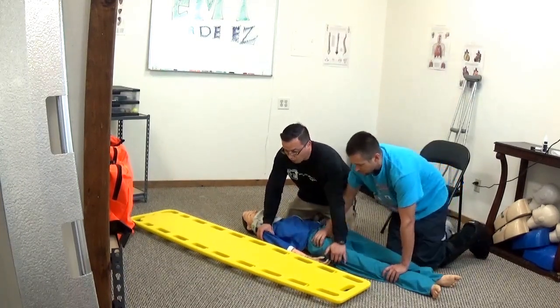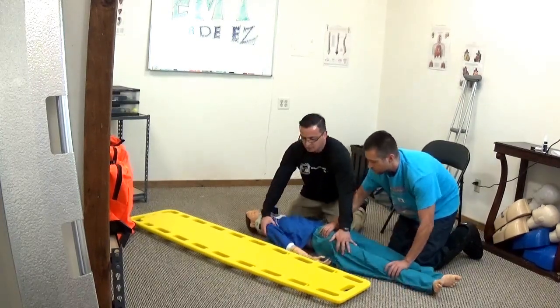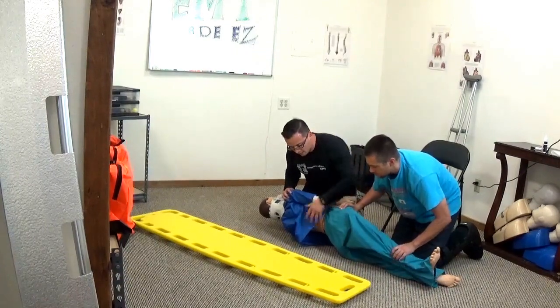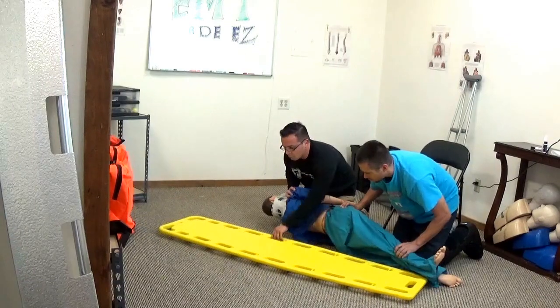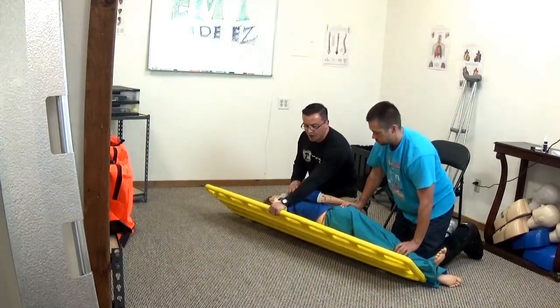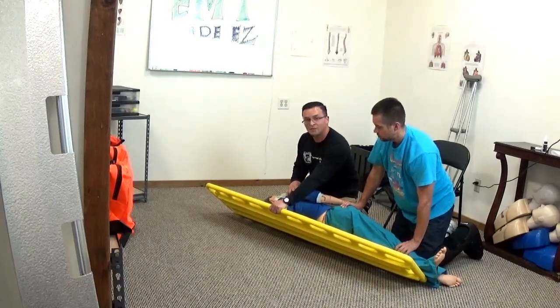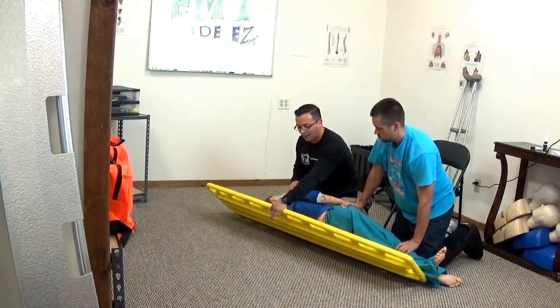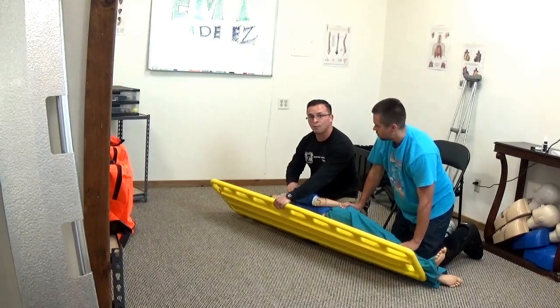On your count, flip the patient toward you. While the patient is on their side, check for deformity, crepitus, and step-off along the spine. Then place the board behind your patient. It's a good idea to hold the board at a 45-degree angle and apply slight pressure — when you move the patient onto the board, they'll land more in line with it.